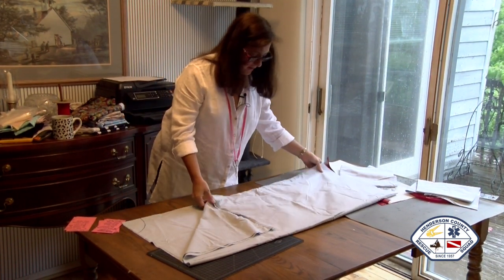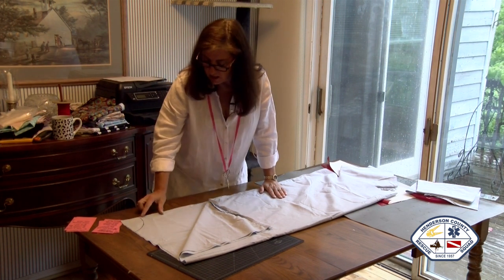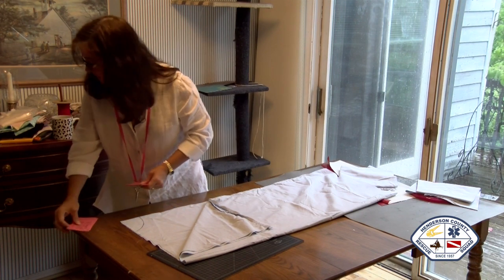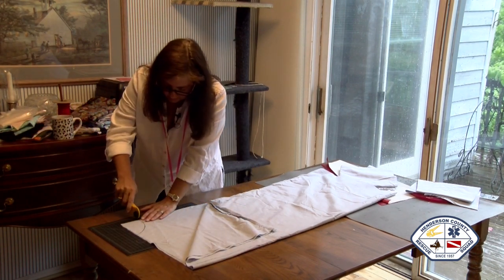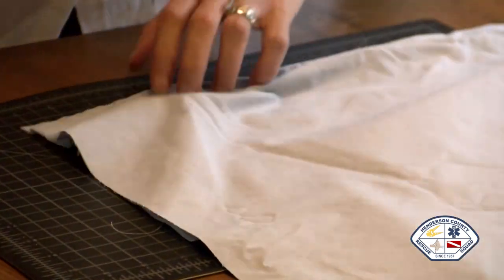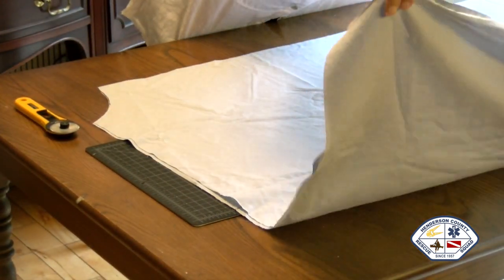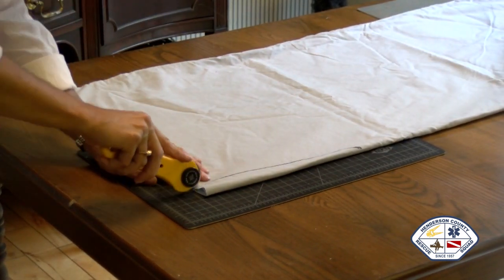Now, the only marks I've done, I went ahead and marked this on my fabric with a Sharpie, because I'm going to cut off the Sharpie part, and it's just a whole lot easier than dealing with tracing pins and that kind of thing. Now, I use a rotary cutter. You're going to cut your neck hole out. Perfect. Now you're cutting both armholes out for the right arm and the left arm at the same time because your fabric is folded in half.